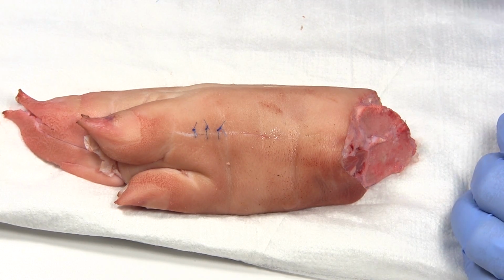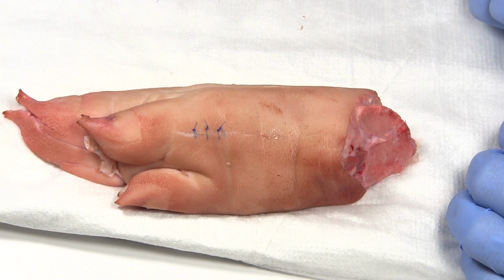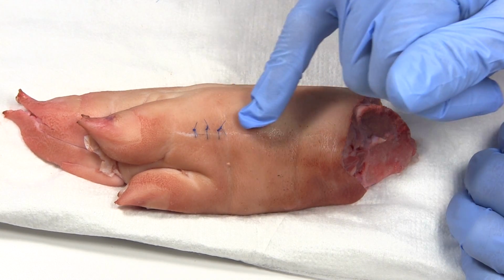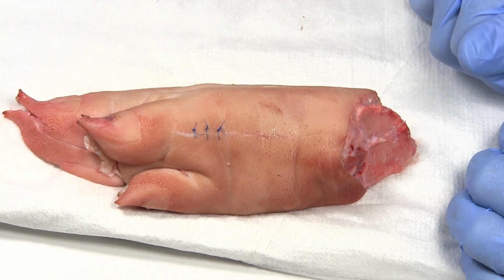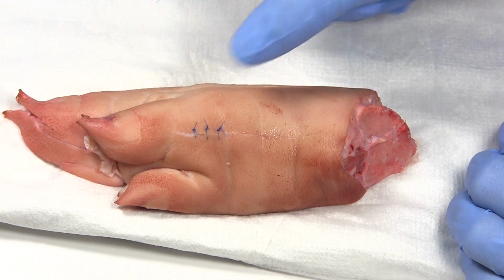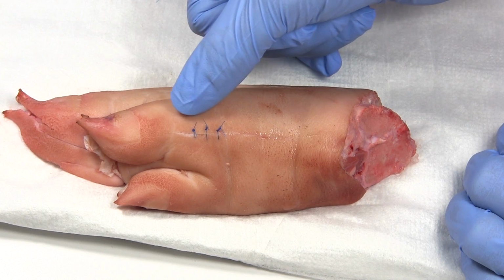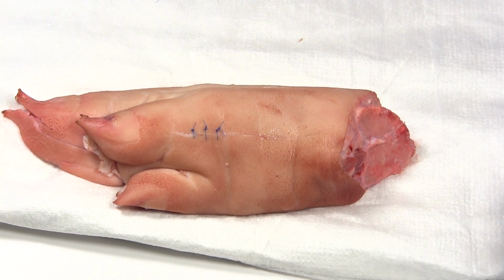Now, a running suture, places to use that: it's going to be quicker to do. So if you have a long laceration, it's going to take less time. If the wound edges are already well reapproximated, like here where there might be some deep sutures or it's just not that deep, it's a good place. Also, it's a little bit more aesthetically pleasing. So on a face, if you're going to have 10 stitches and you have all these knots here, some people, it doesn't look quite as pretty. So on a face, you can use a running suture and it looks a little bit more pleasing.